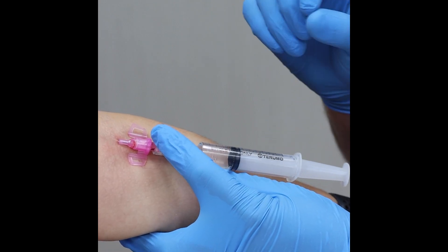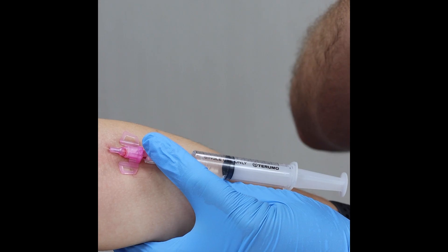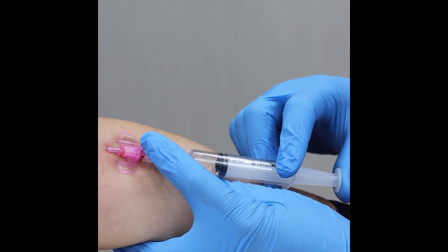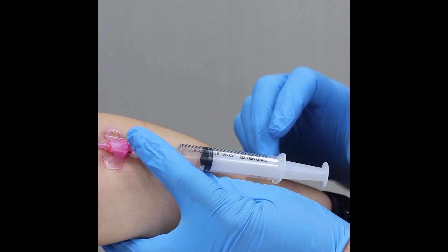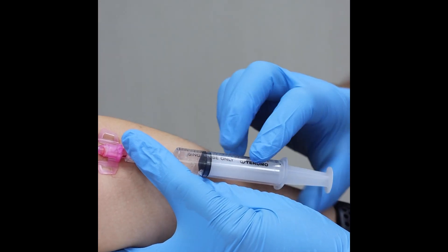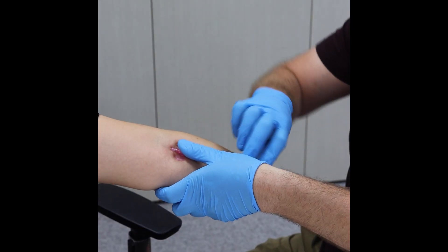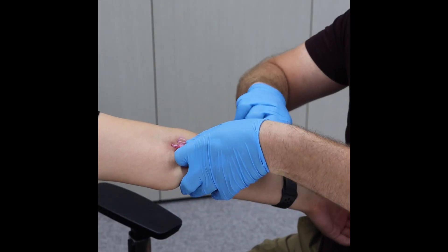If I've hit a valve, by pushing that fluid through, that's opening up the valve, allowing the catheter to then enter the vein nicely and snugly like this. And we've got a patent cannula running smoothly and I'm all good.